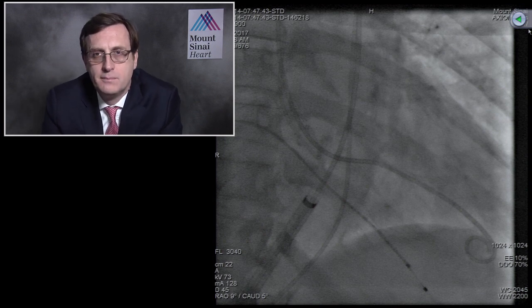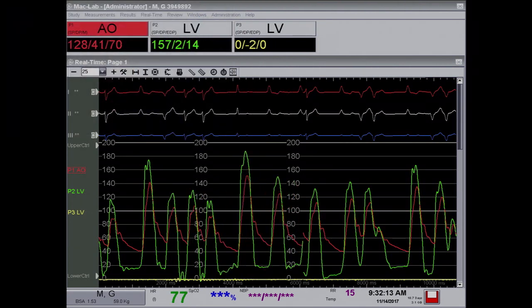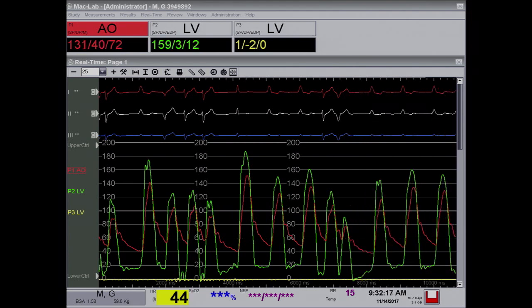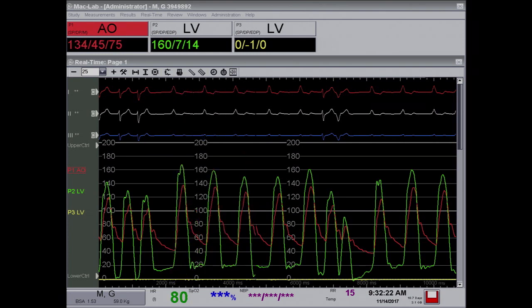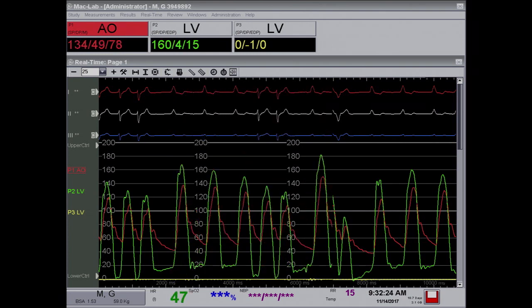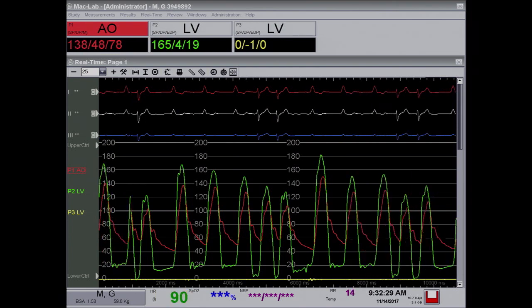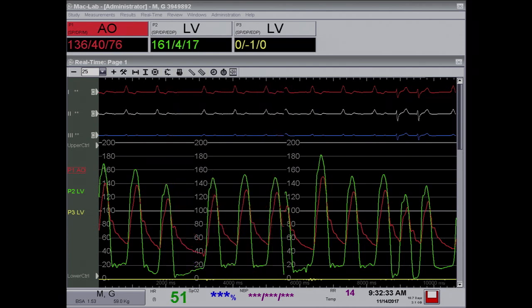Yeah. And now, as a part of the TAVR workup, we have added that they take a picture also with a CT scan for the great vessels. Yes, that's an interesting point. We extend the CT scan window just to include the shoulders of the patient, and that in essence includes the first few centimeters, I would say, a couple of centimeters of the takeoff of the innominate and the carotid, in order to see any proximal tortuosity, because that's all we care about and that's all we fear in this case.